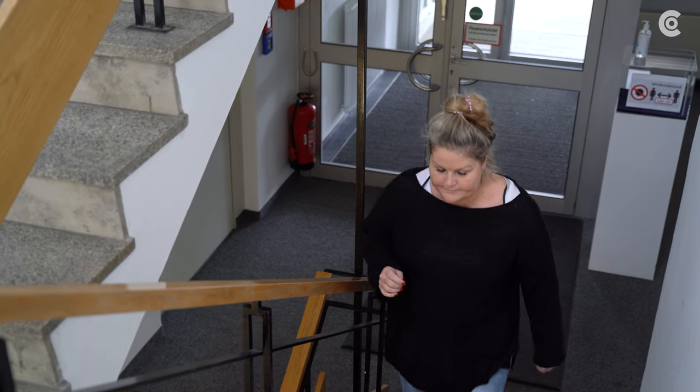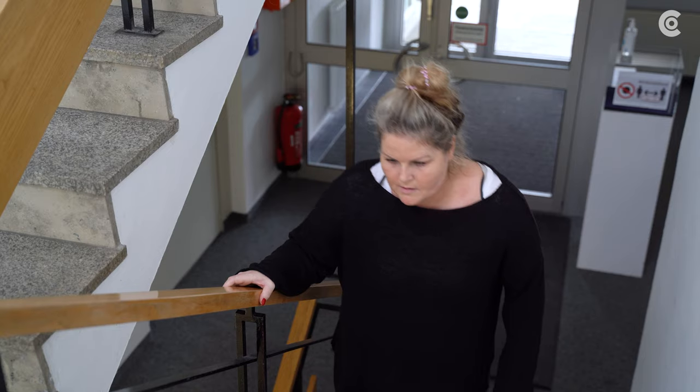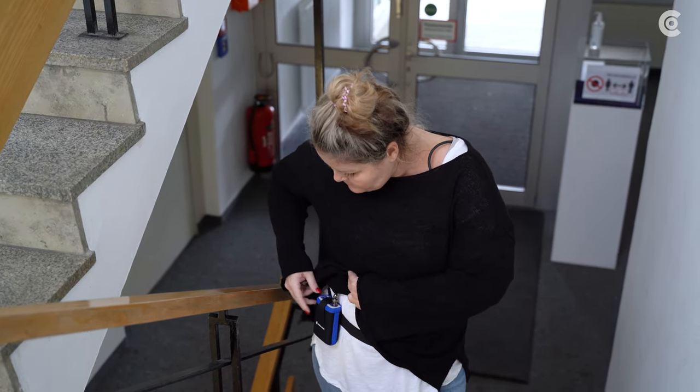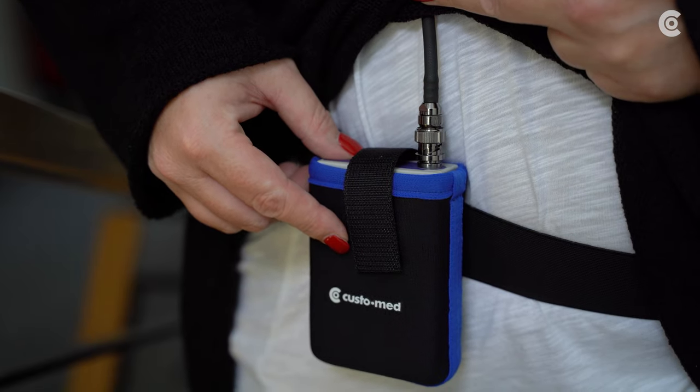What is more, an additional measurement is possible at the push of a button. This measurement should be triggered by the patient when hypertension symptoms such as dizziness arise.